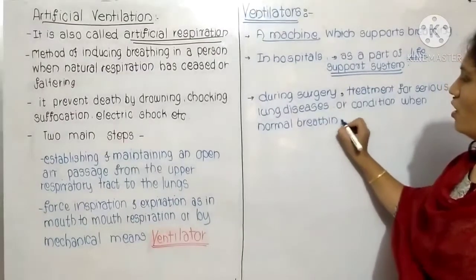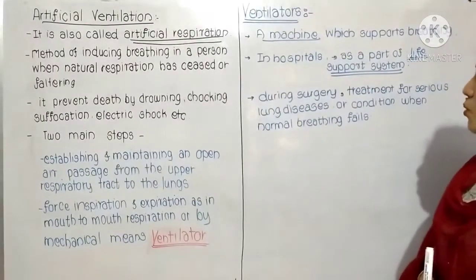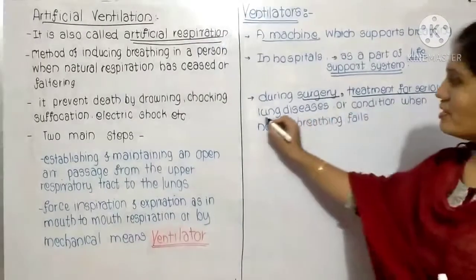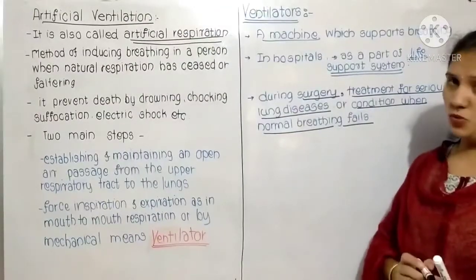When normal breathing fails, this machine is useful. So, as I told you: during surgery, treatment for serious lung diseases, as well as conditions when normal breathing fails, these ventilators are useful.